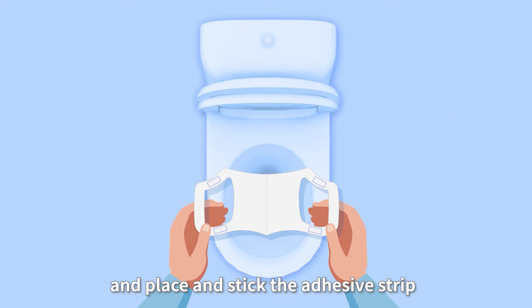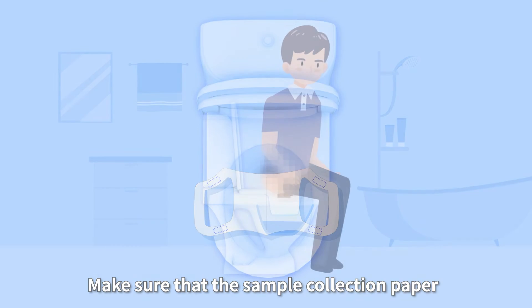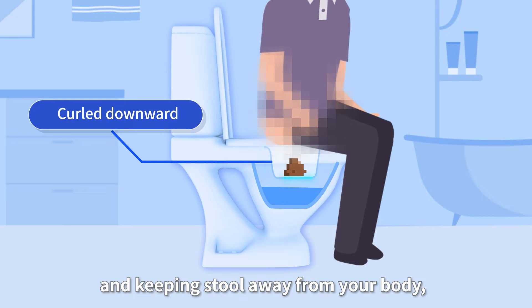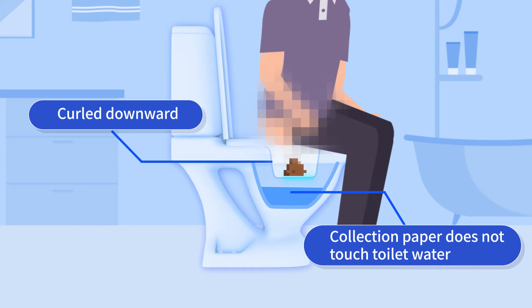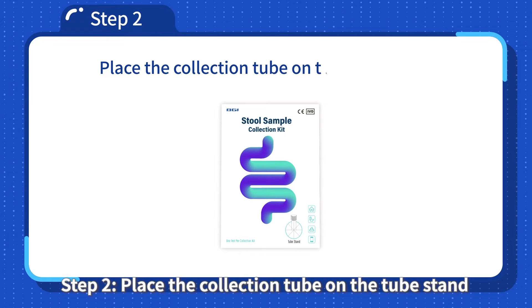Place and stick the adhesive strip of the sample collection paper over the toilet rim. Make sure that the sample collection paper is curled downward, leaving enough space for collection and keeping stool away from your body. Make sure that the sample collection paper does not touch the toilet water.